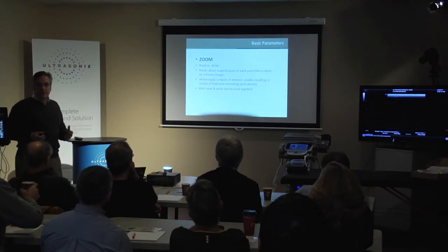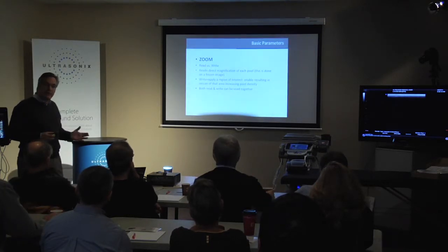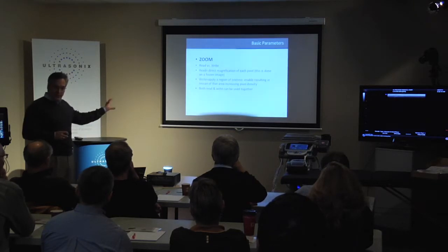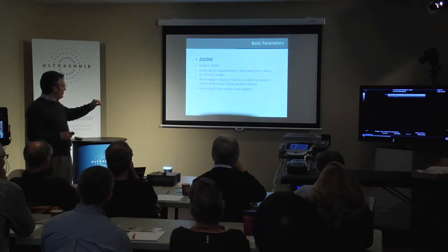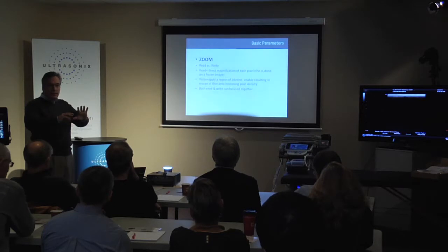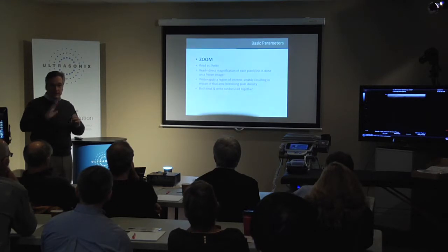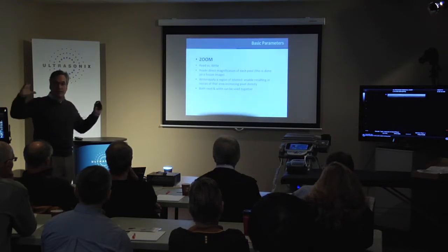Zoom, there's 2 abilities to zoom on the image. There's a read zoom and a write zoom. The read zoom on the basic display is in the upper right corner, as you recall, enlarges the overall information on the image itself. And you can easily just turn the button and it basically blows it up. It may look a little more pixely, but you're taking the existing information and stretching it.